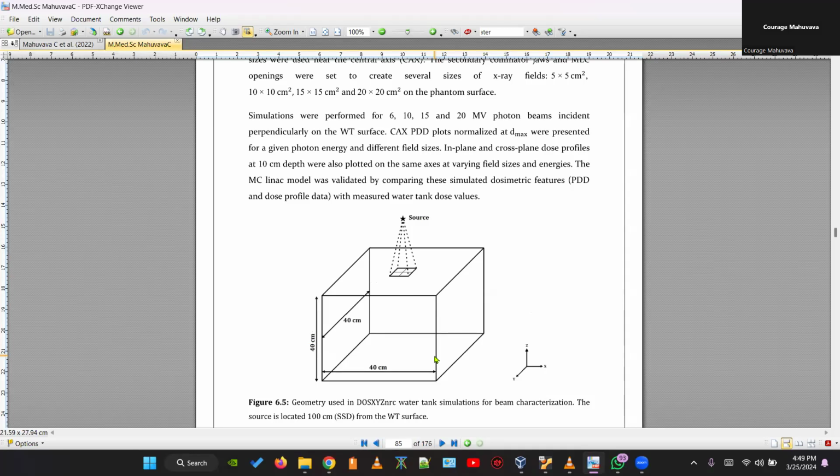All right. So you get a 3D dose file, which is basically a file that consists of all the dose information within the beam. All right. So all the dose in the voxels. So for each voxel, there's a dose value that is assigned to it.